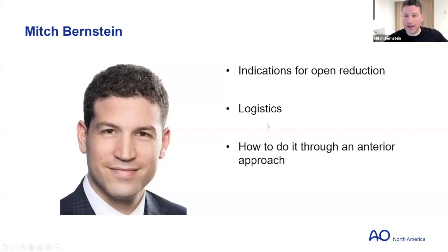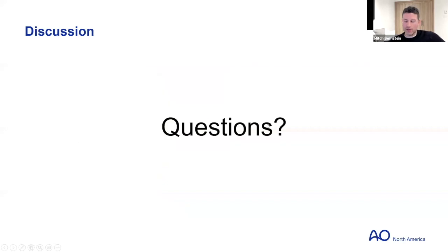We're taking down the lateral femoral circumflex, which comes across anteriorly. I'm not a microvascular surgeon, but I believe those are the vessels that, if you need to do a free fibula, it will typically dock into. But those vessels have not been shown to be the main blood supply to the femoral head. What I don't do is go cranial and posteriorly around to where the medial femoral circumflex enters the capsule.